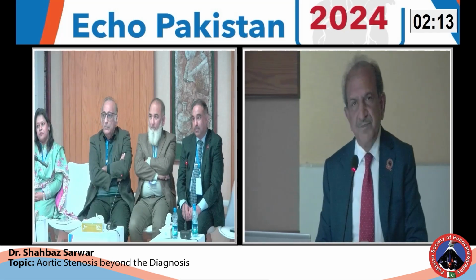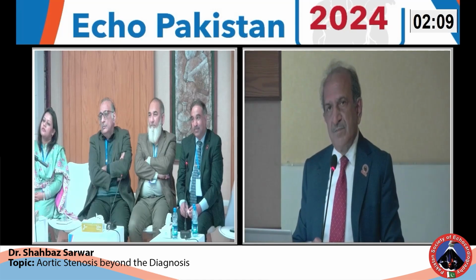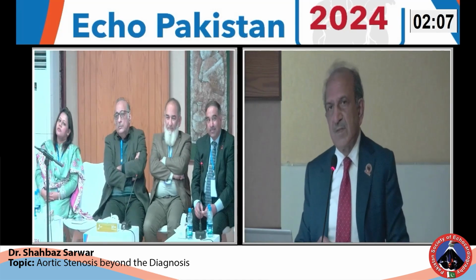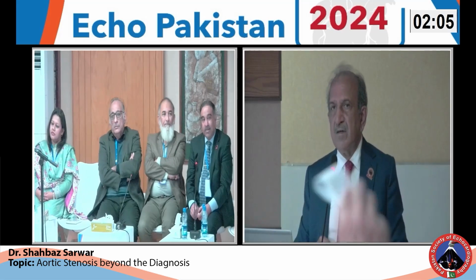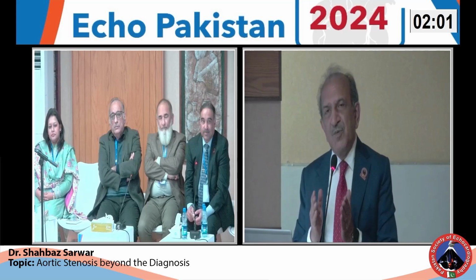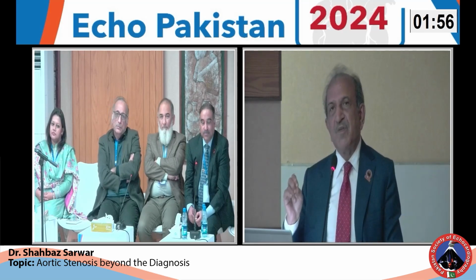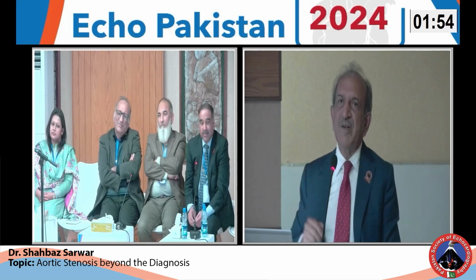That means we should not document the actual aortic valve area. We should document the index. Actually, we should be documenting both. And more importance should be given to the index area, but we should be documenting both.